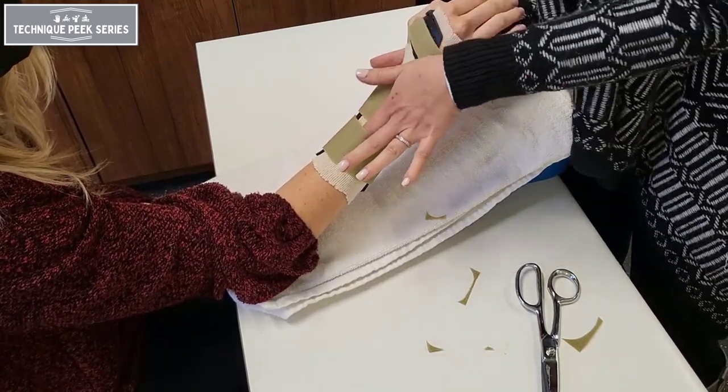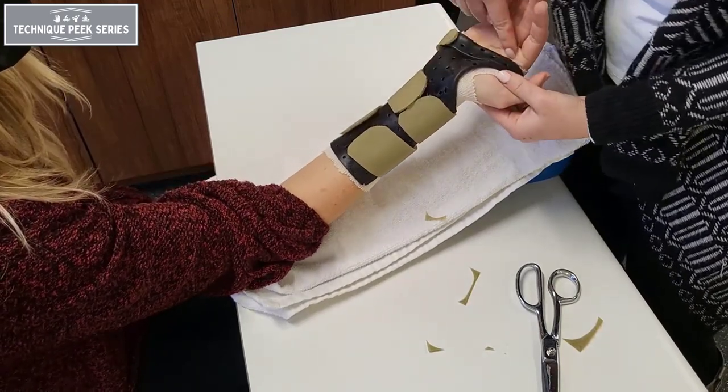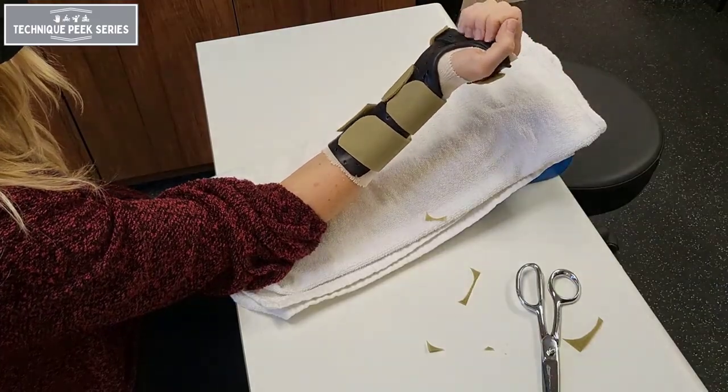Once the straps are fastened, a finger should be able to slip in between the strap and the patient's skin. Check one last time for the distal palmar crease, the thenar eminence, and two-thirds the length of the forearm.